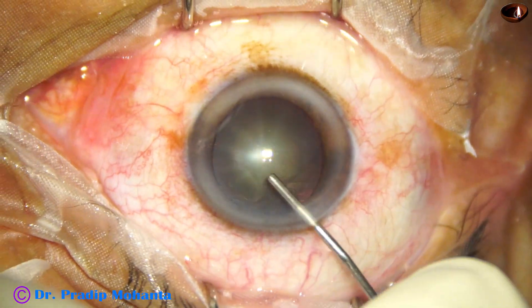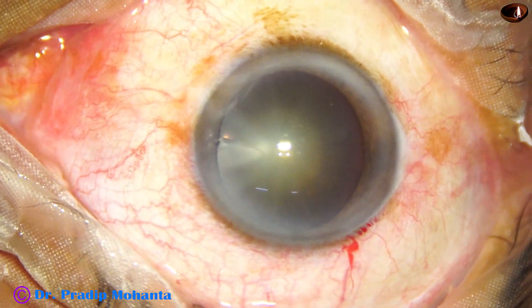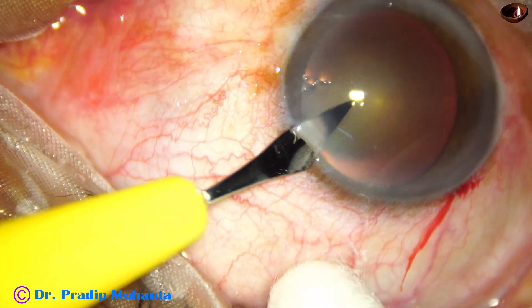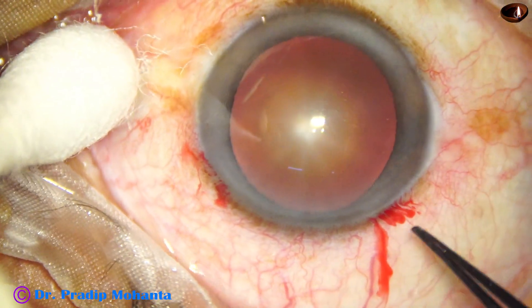Now the anterior chamber is filled up with 2% hydroxypropylmethylcellulose, and then a side port is made on the left side of the main incision. This side port is about 90 degrees away from the main wound.